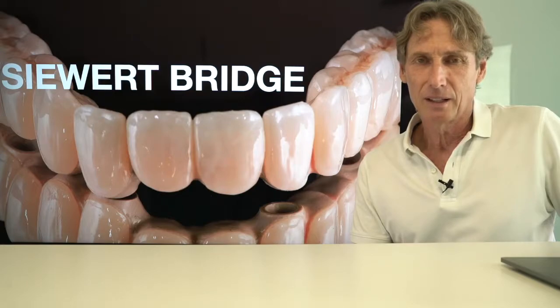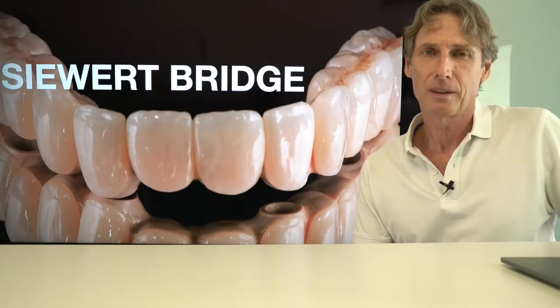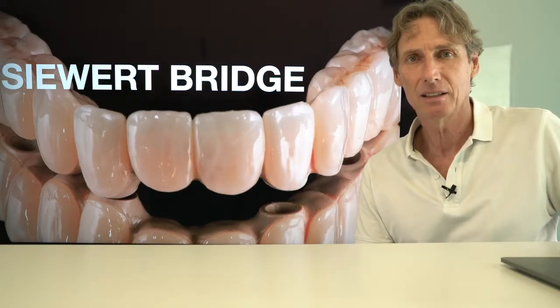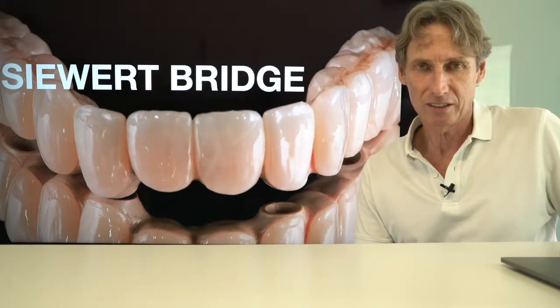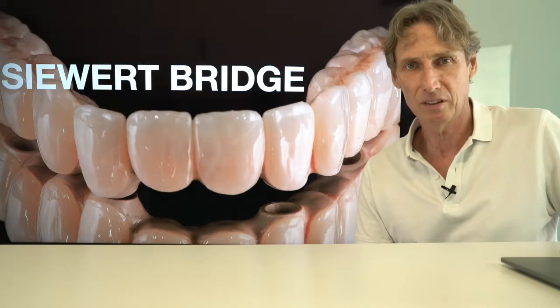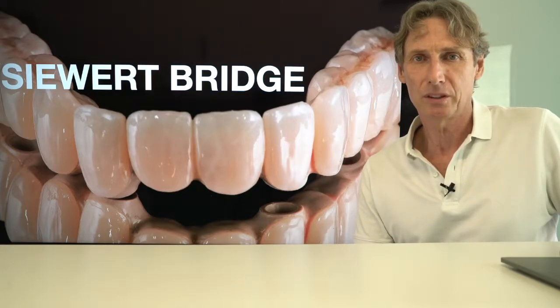Without the progress in dental CAD/CAM technologies and the availability of the PEEK polymer as a dental disc, the SIEWERT Bridge would not exist. In this video, I want to share with you the improvements of the SIEWERT Bridge compared with traditional screwed-on implant-supported bridges.